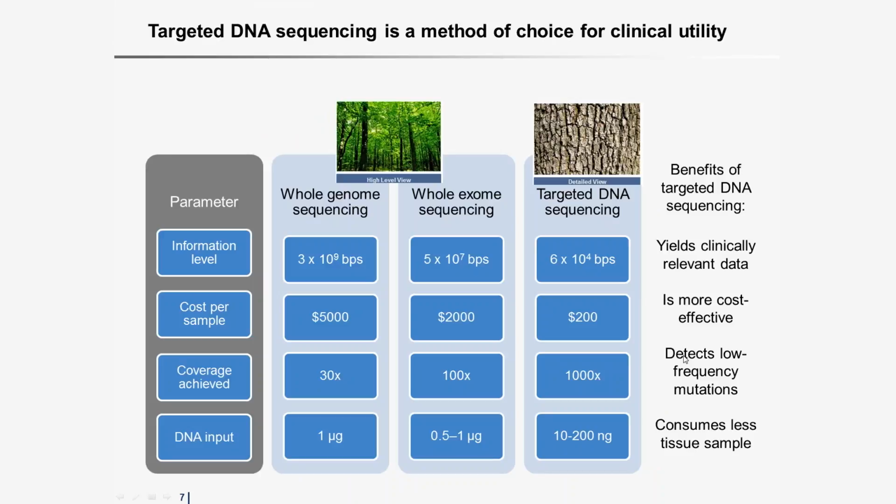So I think that targeted sequencing is here the right tool to answer all the requirements of the clinicians. So we focus on genes or loci which are needed to make a clinical study or to answer the clinically related decisions.